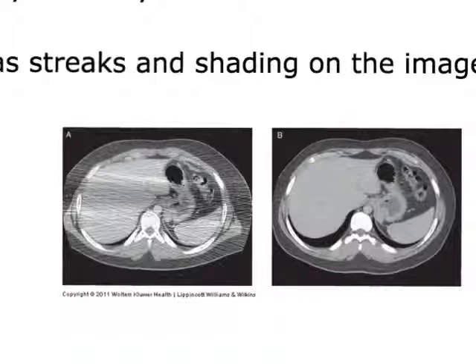So having the patient's arms up for CT scanning is very helpful to avoid those out-of-field artifacts. Even just defining a display field of view or a scan field of view in which anatomy is clipped can create an out-of-field artifact. If I haven't told the scanner to scan the entire area of the skin margin, having skin margin outside of that field of view can cause an artifact.